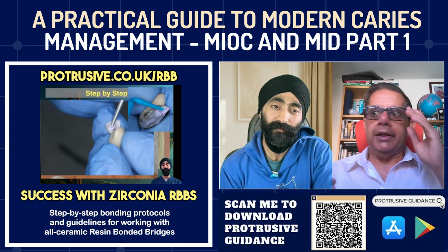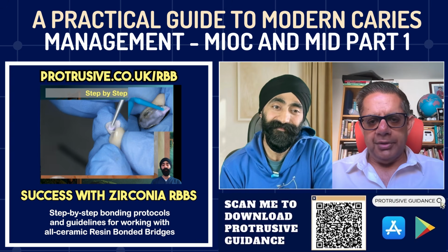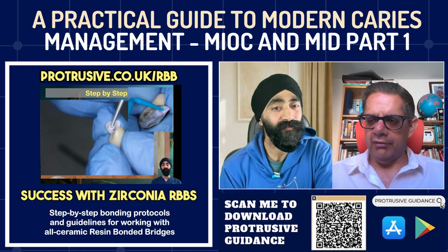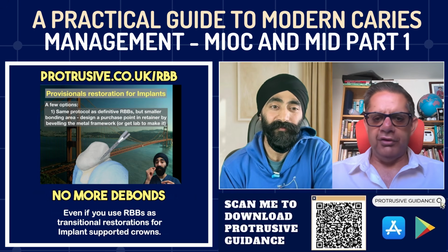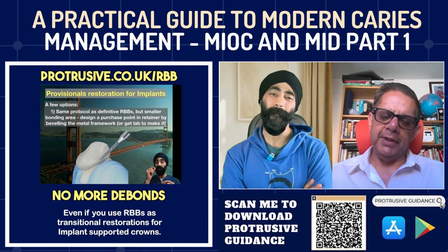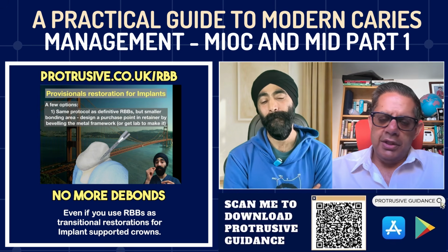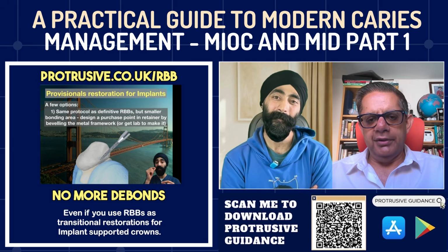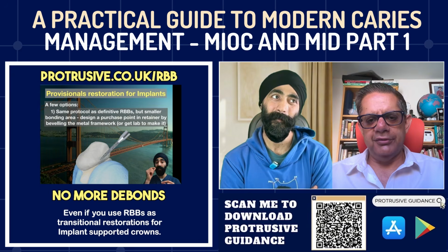If you blindly just take an AI piece of software and let it scan your radiographs, and the radiographs are not very good quality, and it starts telling you there are lesions where there aren't lesions, or they're bigger than they should be, well, you're feeding it. It's spewing out information that it's being fed. So ultimately, the human, the clinician, takes responsibility.